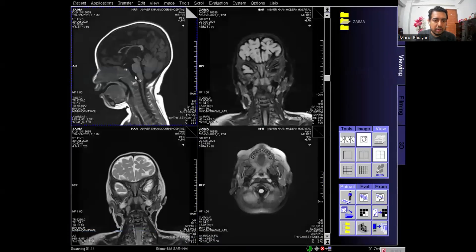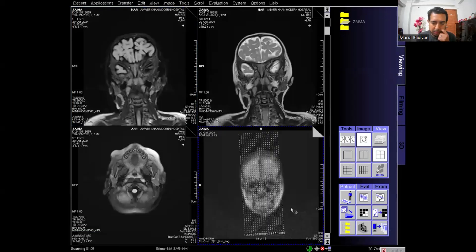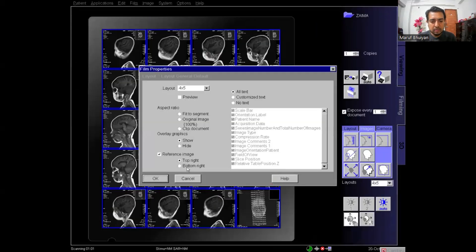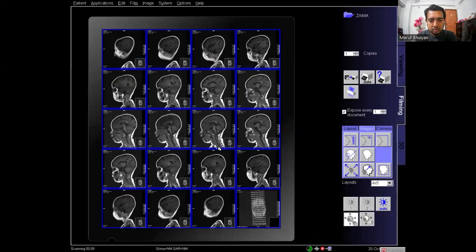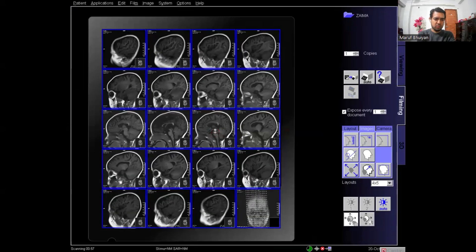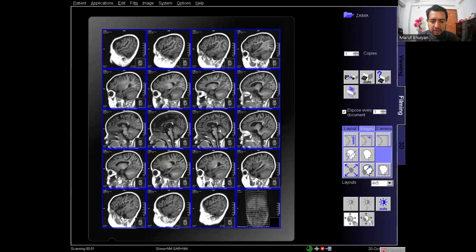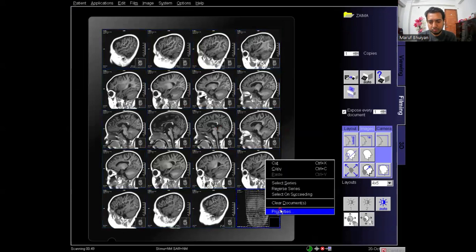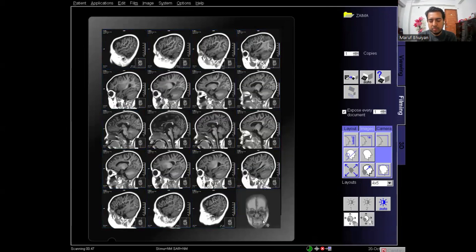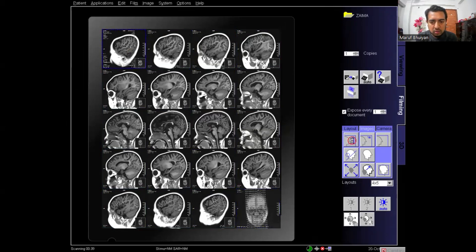Now I will print the T1 images. I select the series and send it to the film sheet, then open the reference image and send it as well. On the filming screen, I select the film layout 4 by 5 because there are 19 slices and 1 reference image. I remove the reference image from the original segment and adjust the window, zoom, and pan.